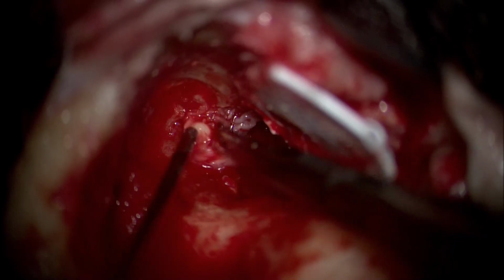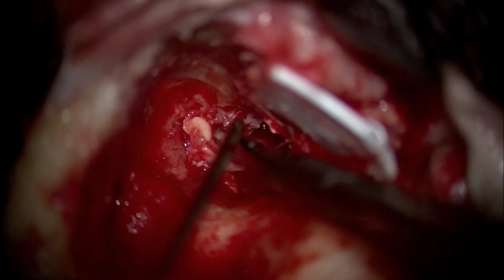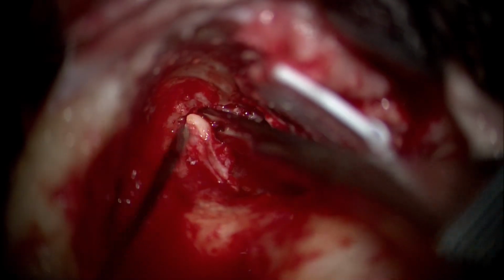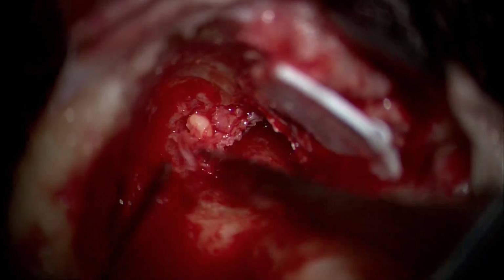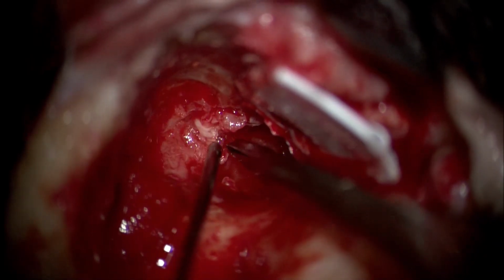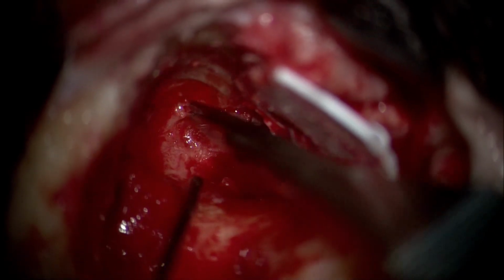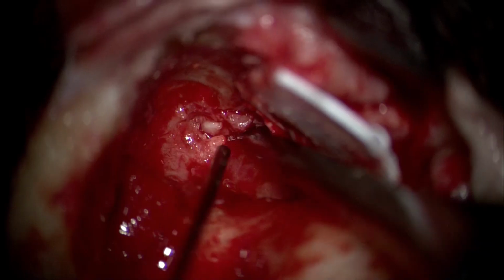And now what you see here is the malleus head, on which there is still some epithelium remnant, which we intend to clear after resecting the malleus handle, not head, handle, from the processus cochleariformis by sectioning the tensor tympani tendon. As you do so, you also see some small sacs of epithelium that lie hidden and buried in the anterior epitympanic recess and the protympanic region.